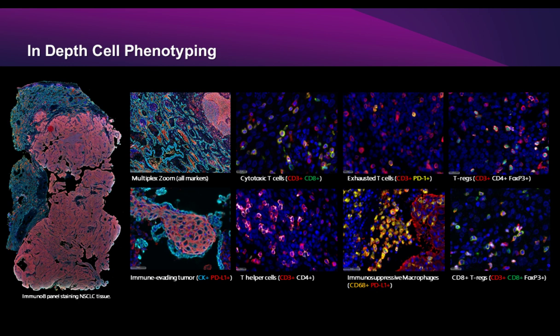I can take that question. So we don't use secondary antibodies. We actually use the DNA barcodes, amplify those, and then come in with complementary imaging strands conjugated to fluorophores to actually detect those primary antibodies that are laid down. And since we're not using secondaries and we're using those barcode conjugates to do the detection, we can have any species of antibodies in our primary antibody cocktail. They can be sourced from mouse or rabbit. It does not matter. And then what was the second part of that question?